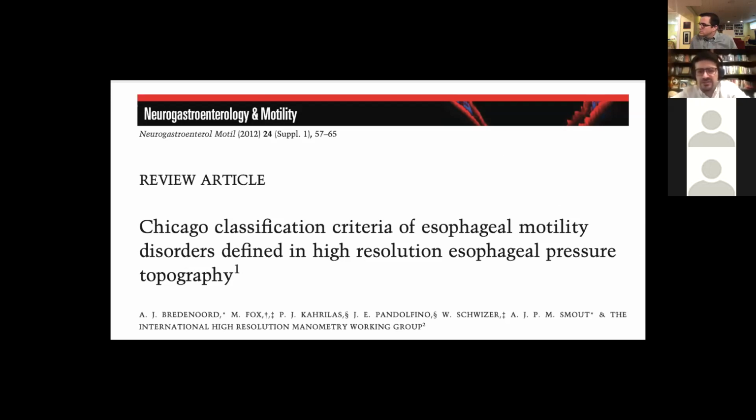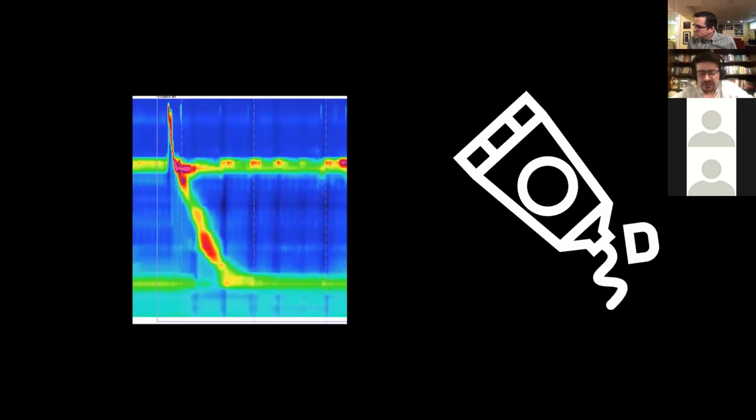Now, before we dig into these types, just to add to what Rob said on the diagnosis, when I'm talking about manometry to anyone, I always make the analogy of toothpaste being squeezed out. If you want to squeeze out all the toothpaste in one go, you'd probably start at the very top and work sequentially towards the bottom. But for that to happen, the cap needs to be off, right? If the cap isn't off, the toothpaste isn't going anywhere. I think this is a nice analogy of what happens in achalasia.